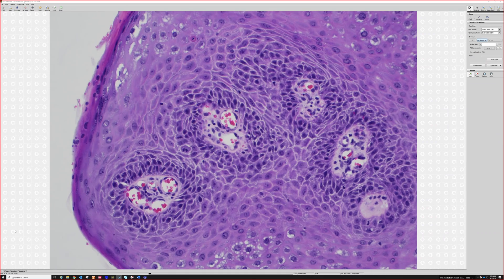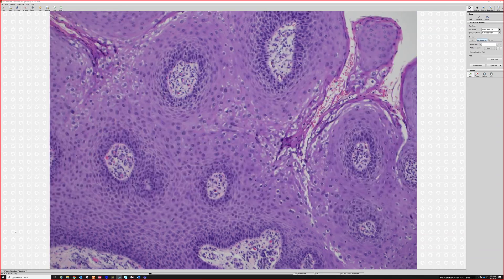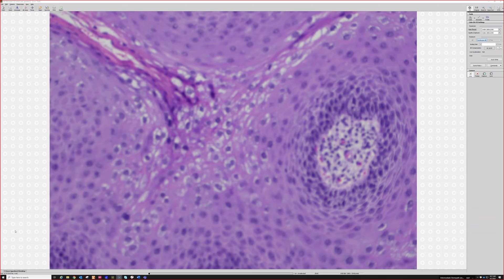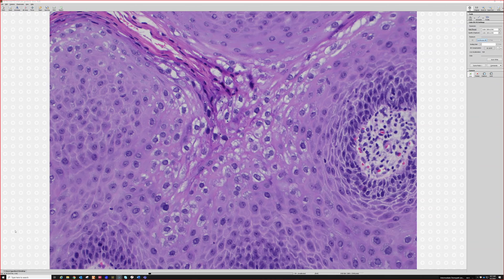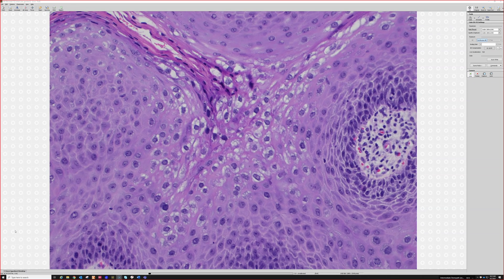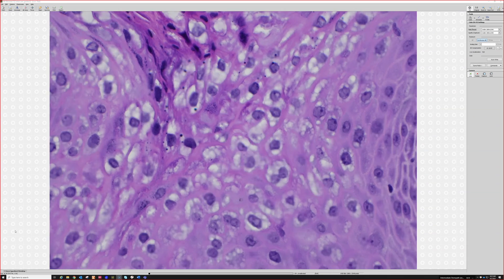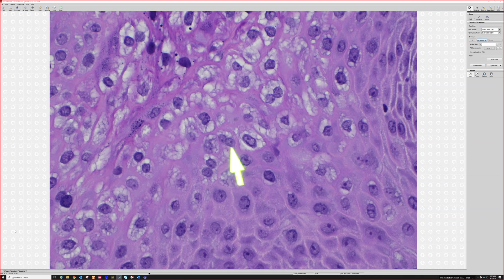Ideally I want to see koilocytes, and this particular case is loaded with them. Koilocytes are usually located in the upper spinous or the granular layer. They not only have pale or vacuolated cytoplasm, but also really large nuclei — and sometimes two nuclei sitting together inside one space. You can see a binucleated one right here.